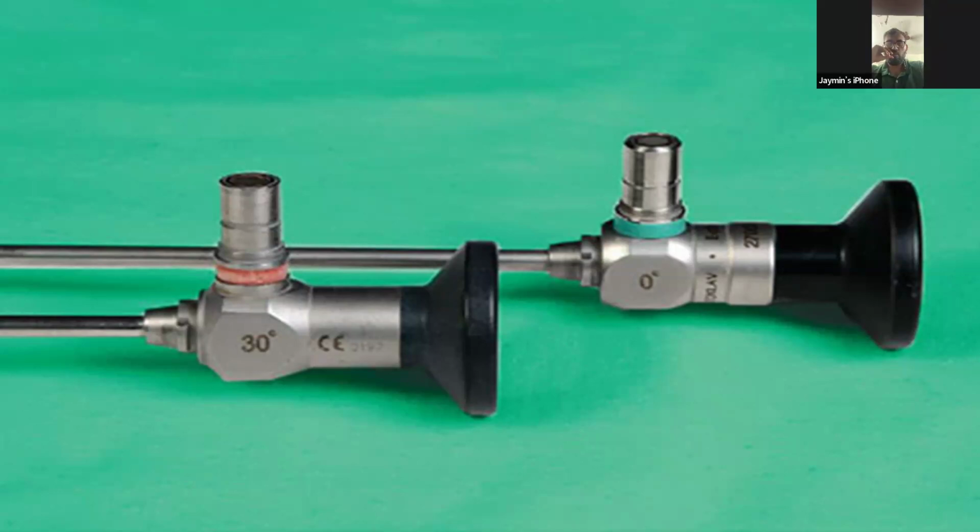Hopkins 2 number of glass rods is more when compared to Hopkins 1. Hence, the vision is much better when compared to Hopkins 1, sir. So in terms of brightness and resolution, and the air inside is reduced. As the glass rods increase, one is basically for the image transmission, the other is for the light transmission.